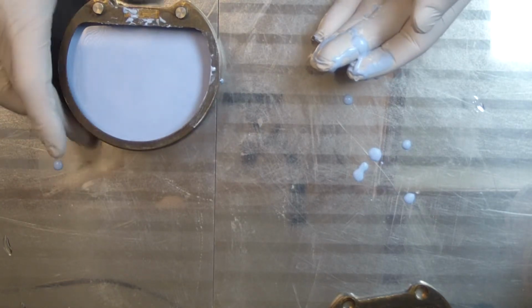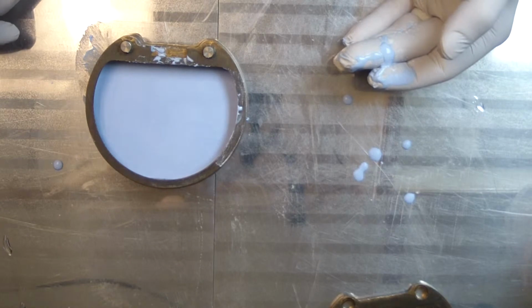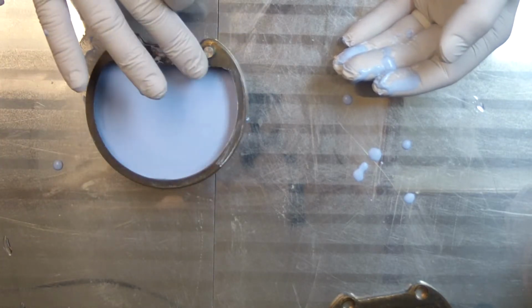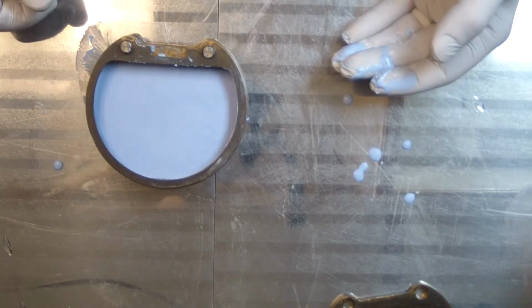Okay, so I pour just enough to cover all the teeth. I don't go any further up than that. The reason why I do that is because when you're going to be deflasking your case, it will make things a lot easier if you have a second and third pour.